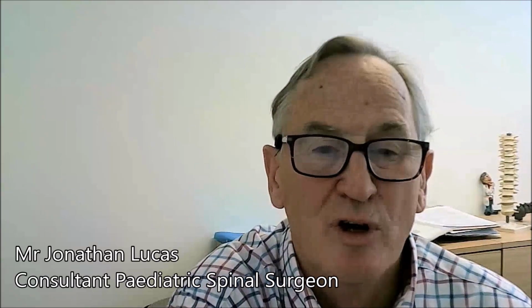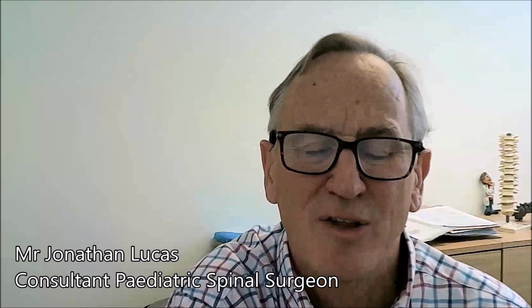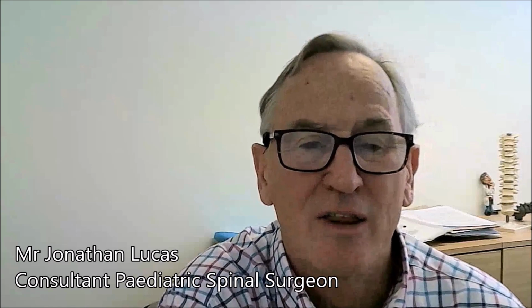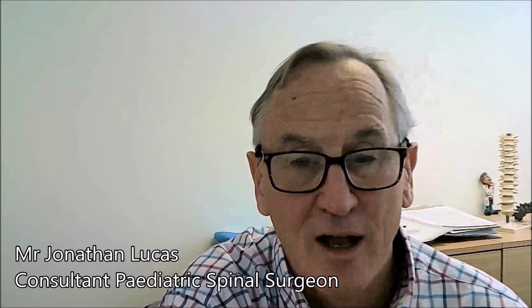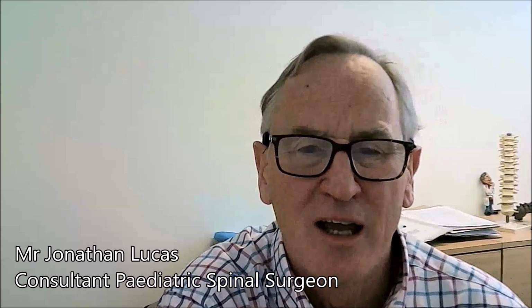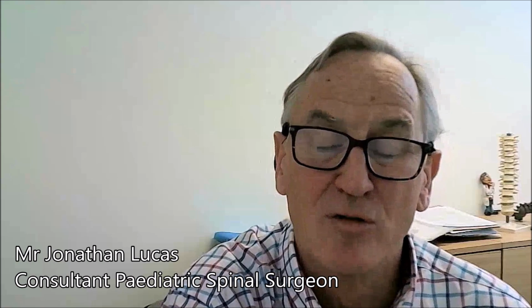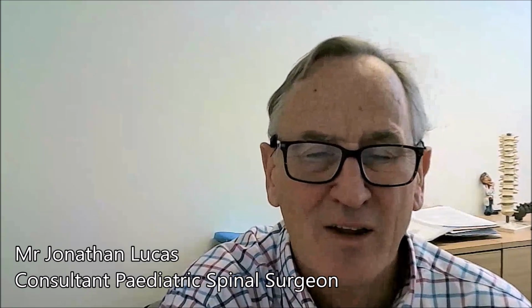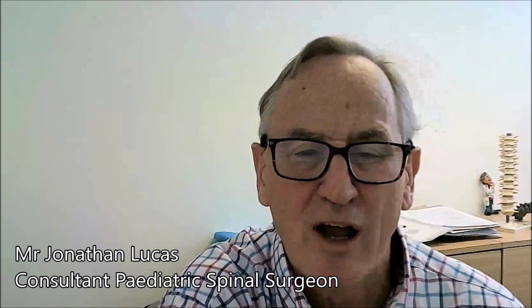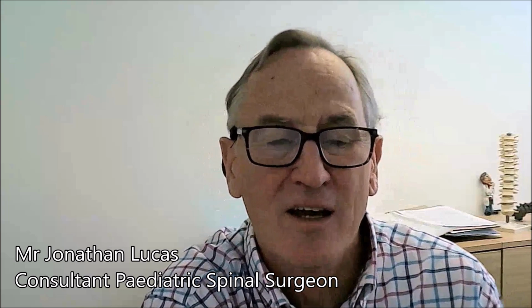Image guidance navigation is a mechanism of having real-time 3D images generated of the spine within the operating theatre that allows you to see the anatomical bony landmarks in 3D on a screen while you are working on the bone in order to insert the implants that allow you to have the fixation points to correct the spinal deformity. And this is a real step forward to allow more accurate placement of the implants, principally the screws that allow you, as I say, to have fixation of the spine.